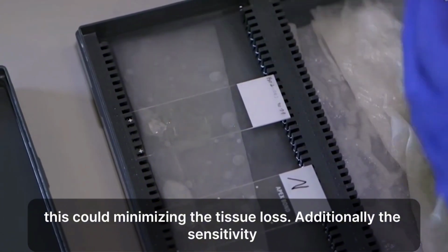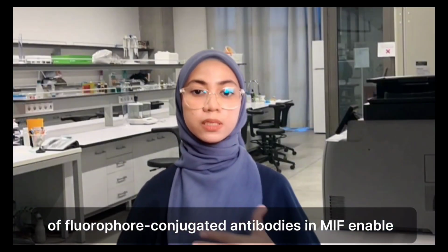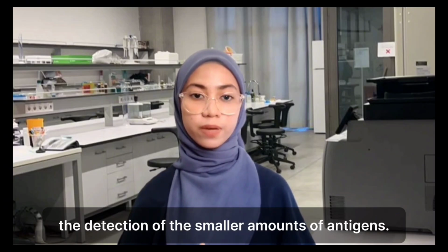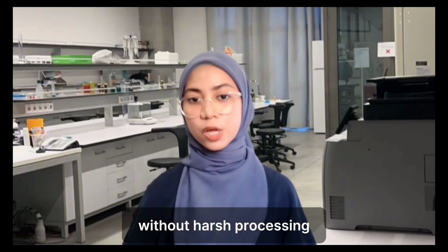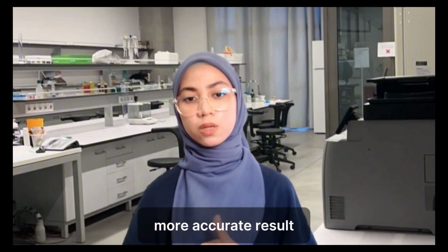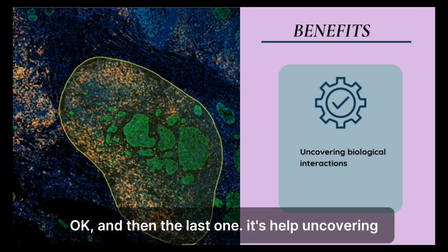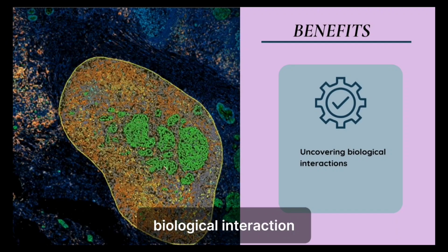Additionally, the sensitivity of the fluorophore-conjugated antibody in MIF enables the detection of smaller amounts of antigen without harsh processing, reducing the risk of antigen degradation and ensuring more accurate results compared to traditional methods such as H&E methods. Okay, and then the last one is helping uncover biological interactions.